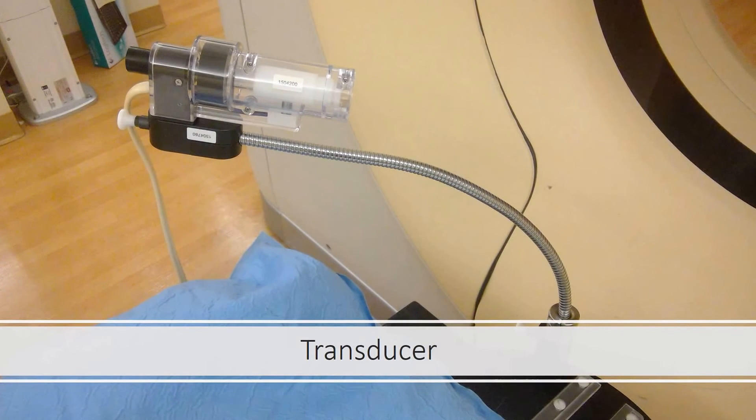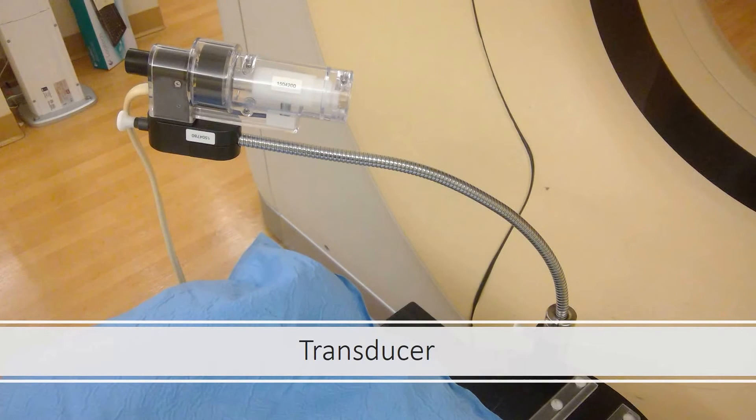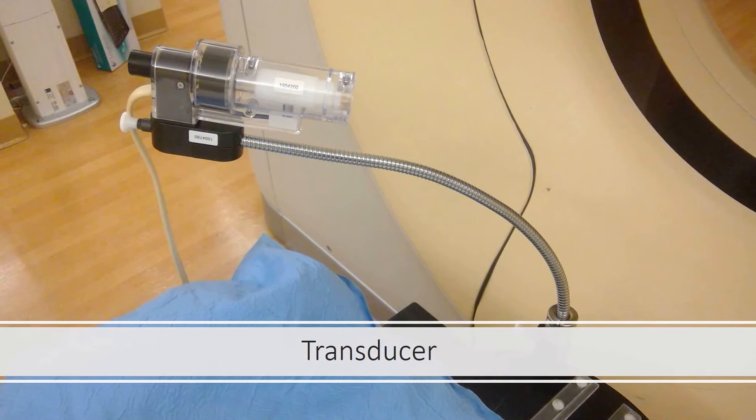This device is called the transducer. It aids you in holding your breath. Once you reach threshold, this device locks and you can't breathe in anymore or breathe out until you release the green button. This helps you stay at the same lung volume so that you don't have to worry about holding the same amount of air in yourself.